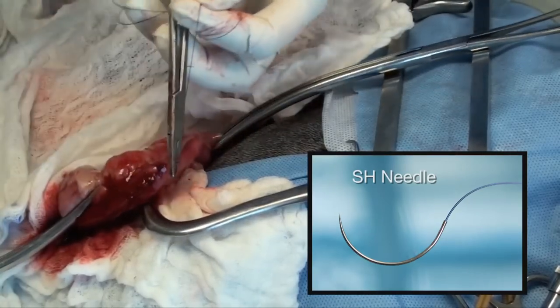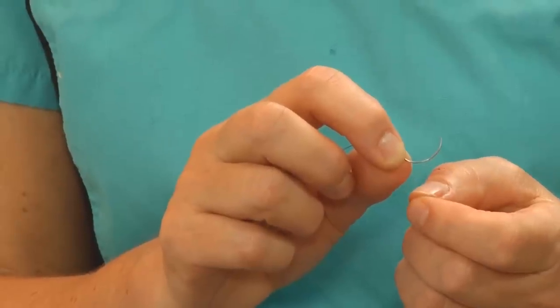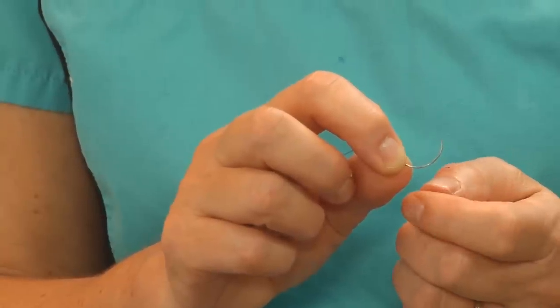Again, the SH needle I'm using is a taper point needle. The taper point is an atraumatic needle, and that's what I like to see in the bowel. I avoid reverse cutting needles or any type of cutting needle for the bowel — I like the taper point.